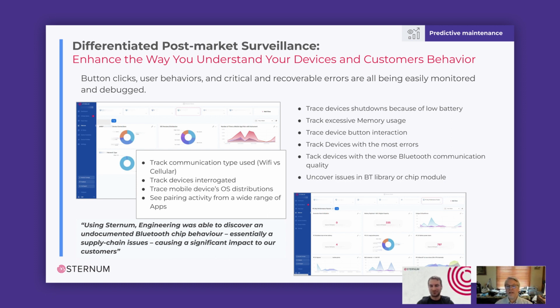Some of the other more interesting things though is we hear complaints from the field sometimes about the battery discharging while it's being used and shutting itself down. And we wonder, well, how often does that really happen? So we instrumented the code and we can monitor that. We can see how often while they're using it, it loses power. And it turns out that it's like 0.01% of the time. So that's very useful information, because if it was 10% of the time, that would be a lot different. And then we didn't need to take a closer look at how we're managing the battery and the battery capacity. So that seems to be a reasonable rate of occurrence.